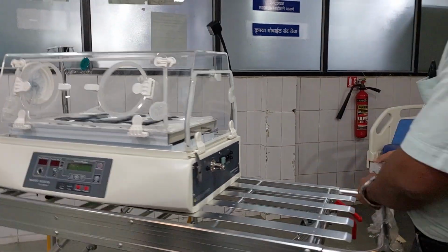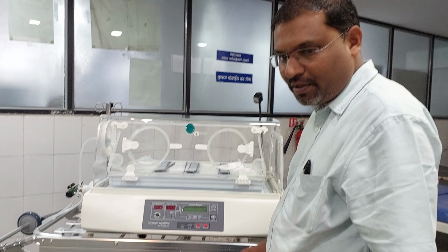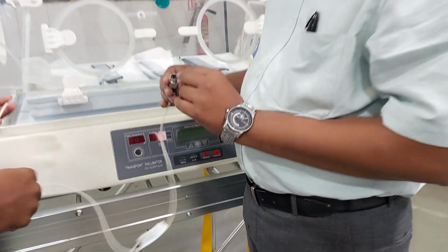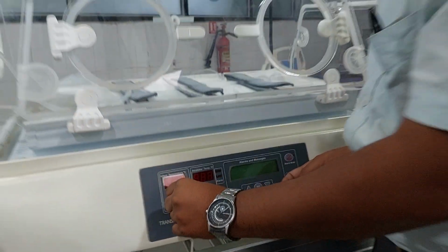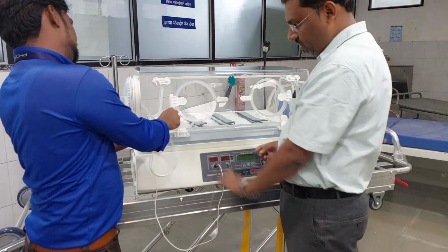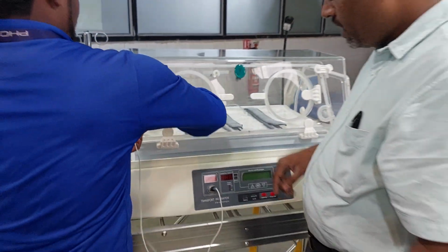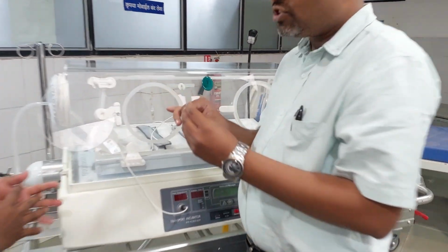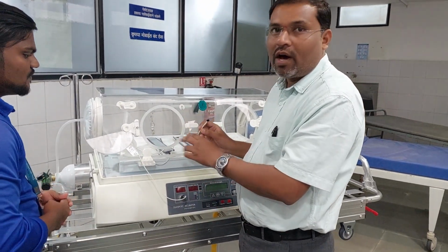Now suppose we are going to make the connections. We will connect the air probe here. Sorry, this is the infant temperature probe. While connecting this temperature probe, always remember that they have provided one notch here. Try to adjust that notch, and after that, just rotate it in the anti-clockwise direction, it will get fixed. They have provided one opening here. With the help of this, you insert this probe, and that probe we have to attach to the baby. Always remember, this probe you have to attach to the baby's skin, so it will sense the baby's temperature, and accordingly your warmer will work.